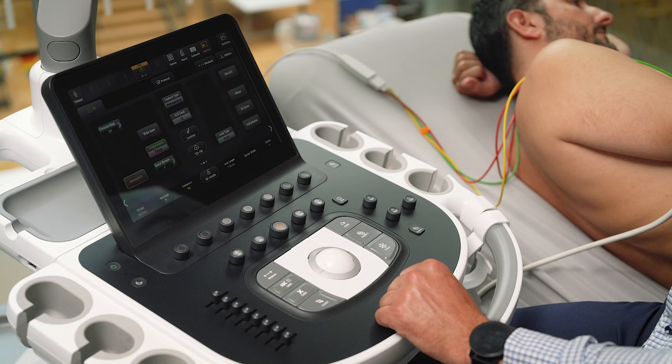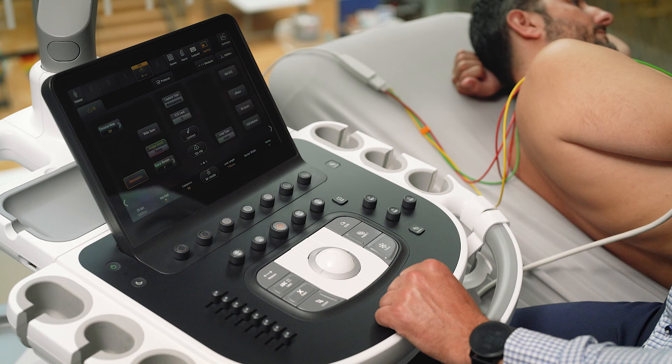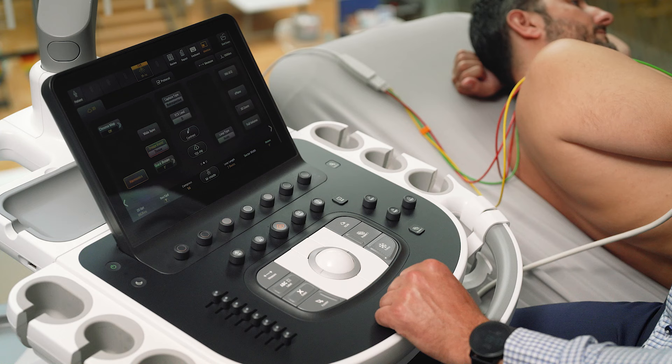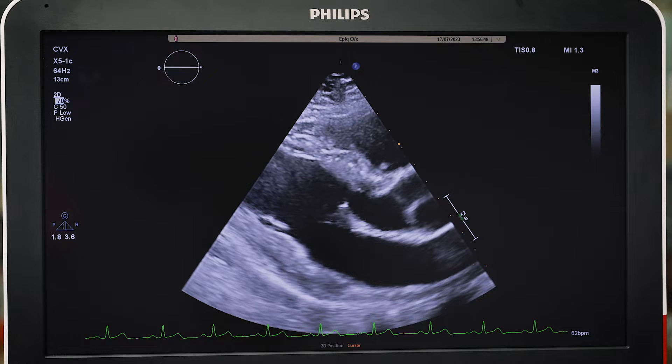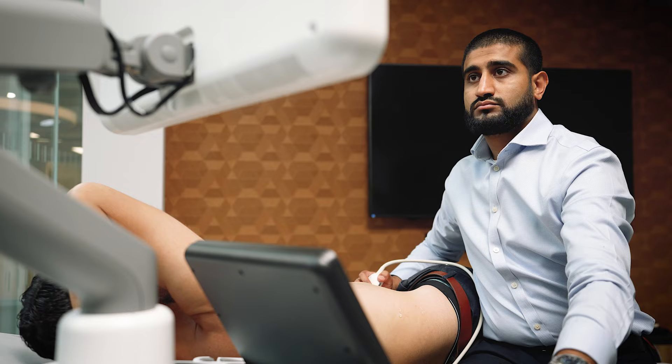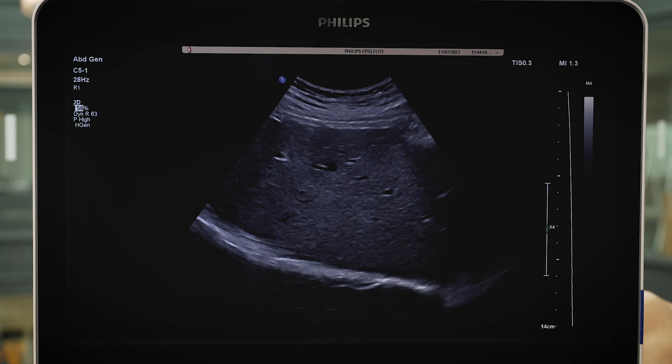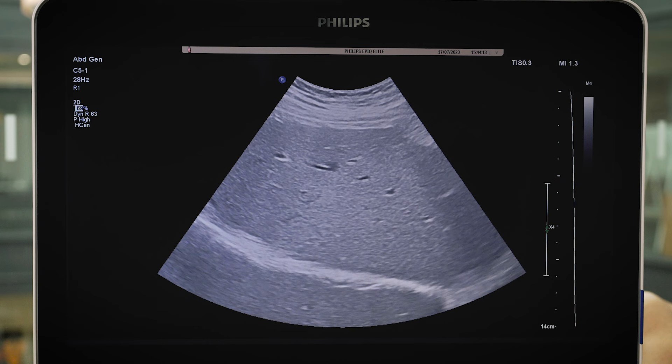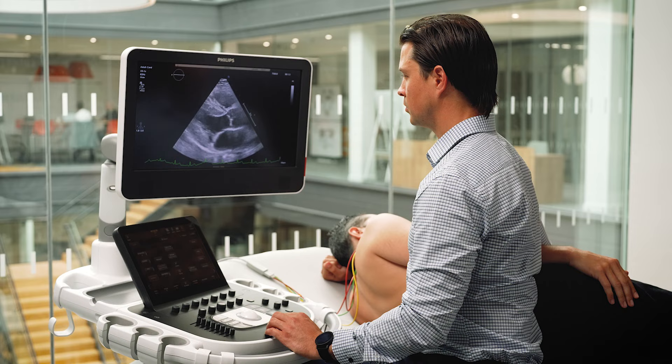Now let's start with the fundamentals. Gain can be found on the 2D rotary dial. It can be increased or decreased to optimize the blood pool and endocardial border definition. Gain amplifies all returning echoes, so clockwise rotation will result in a brighter image and vice versa. Gain does not impact the beam density.